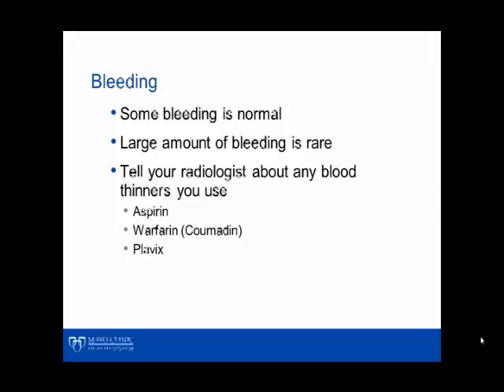If you are coughing up large amounts of blood, and this is concerning to you, you should go to the emergency department. There are a few things that can increase your chance of bleeding, including the use of blood thinners like aspirin or Coumadin before your procedure. At your clinic visit before your CT-guided lung biopsy, the radiologist will direct you to stop any and all blood thinners before the procedure. If you remember only one thing from this video, remember this. If you are taking any blood thinners, please let the radiologist know.